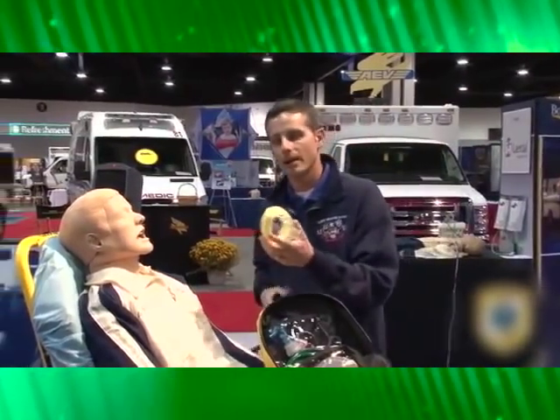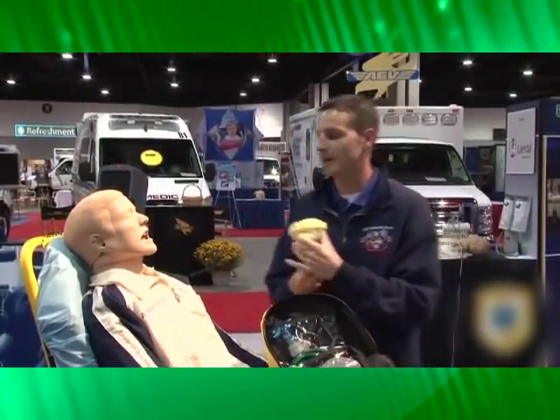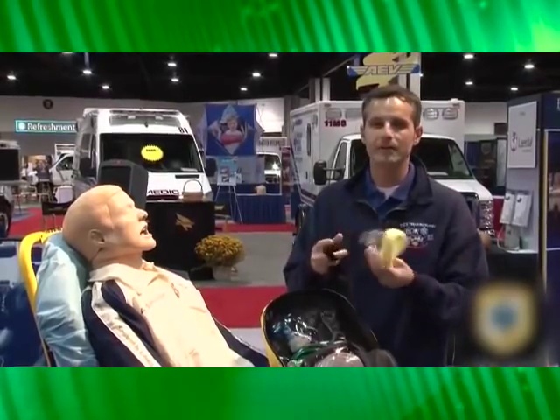I always recommend when you're letting a patient do CPAP — if they can, have them hold the mask and bring it up and take the first few breaths before you try and actually strap the mask on. It gives them more of a sense of control, and it also helps prevent them from getting very anxious and trying to pull the mask away.